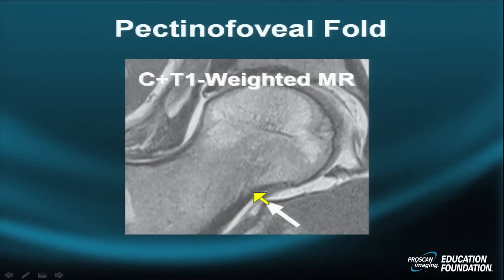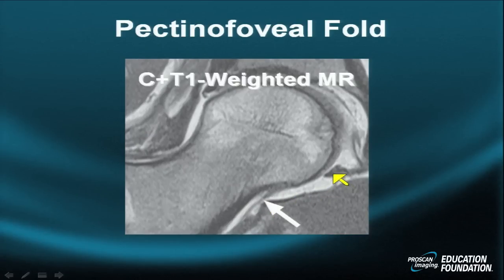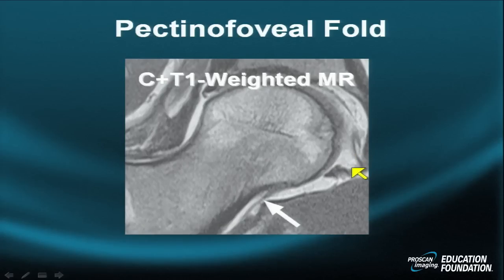The pectinofoveal fold — sometimes called the inferior plica — lies in close proximity to the inferior transverse acetabular ligament. The transverse acetabular ligament is continuous with the inferior labrum and the inferior aspect of the ligamentum teres, which has a ligament-to-ligamentous origin.